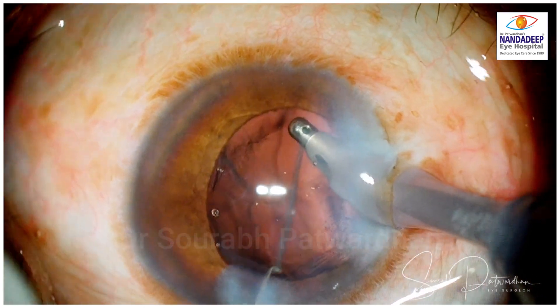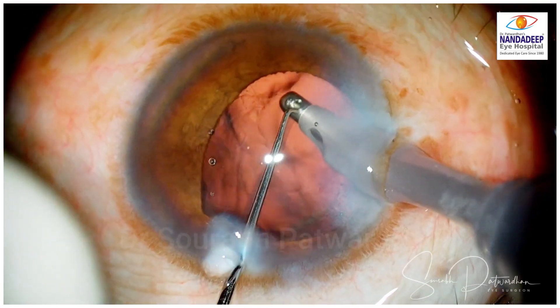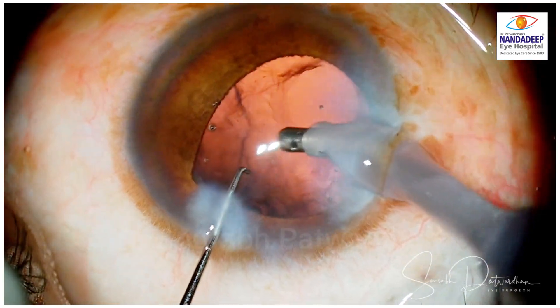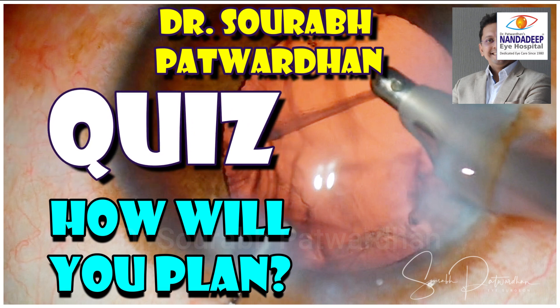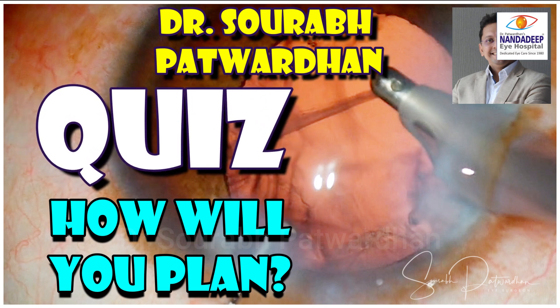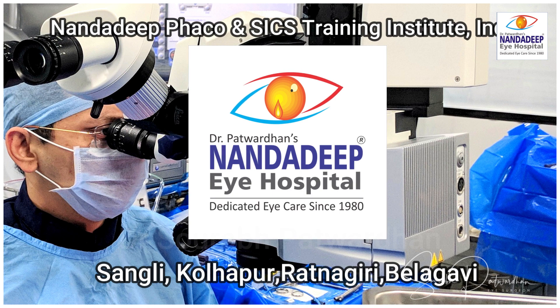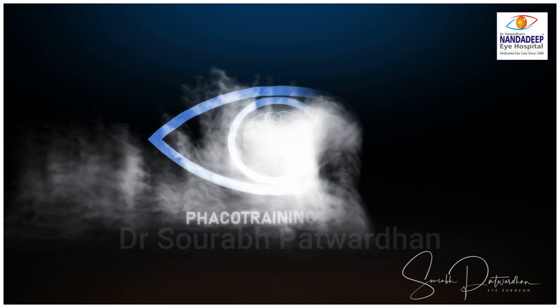I am going to push the reflux button so that the trapped vitreous strand can be taken out. You can go back and watch the video again — you will find there is a difference in structure between a cortex and a vitreous strand. A vitreous strand is more like an elastic fiber and cannot be pulled out as easily as a cortex fiber. The question is: how will you manage this case further? Do comment about this case on the channel and share your views. This is a very important video for all surgeons to watch so they can detect the presence of a vitreous strand early and manage the case.